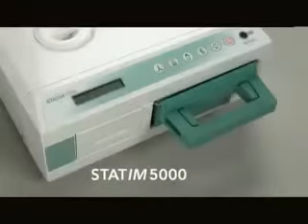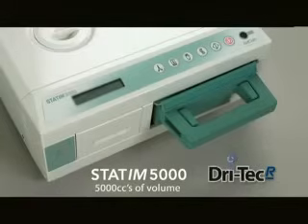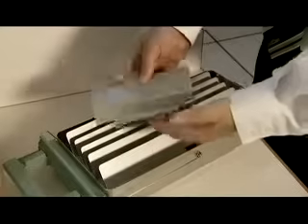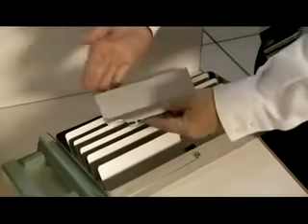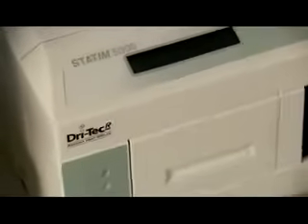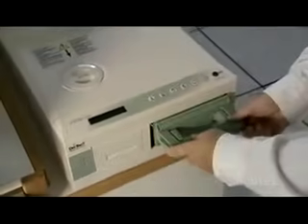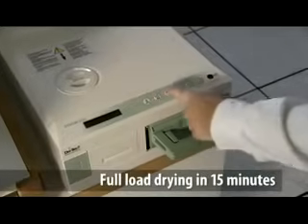The Statum 5000 with DryTec R is perfect for the mid-size practice with 5,000 cc's of volume. The R in DryTec R stands for Radiant Heat Drying. The Statum 5000 uses heat generated by the sterilization cycle, which is absorbed by unique drying plates located in the sterilization chamber. The heat is transferred from the drying plates directly to the instruments, resulting in accelerated full-load drying in as little as 15 minutes.